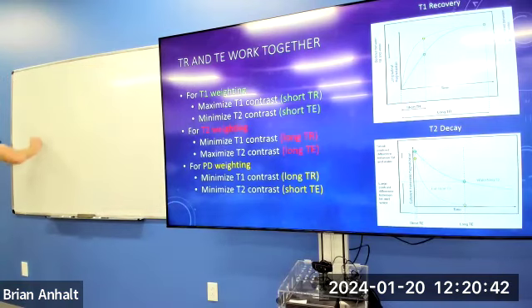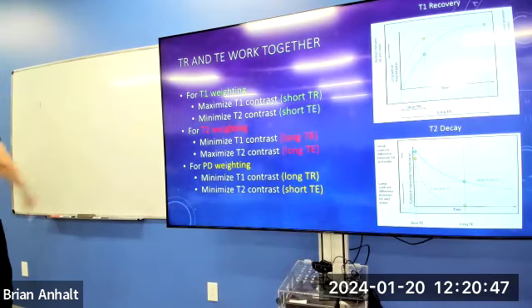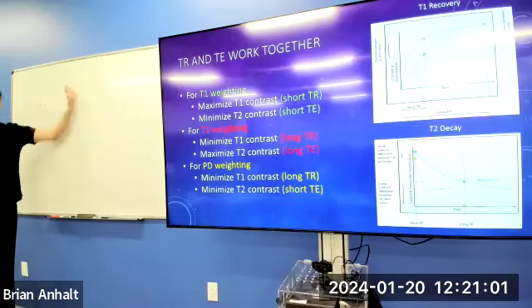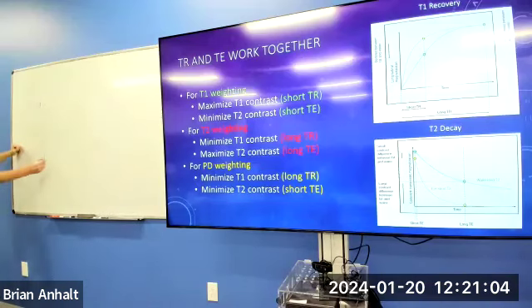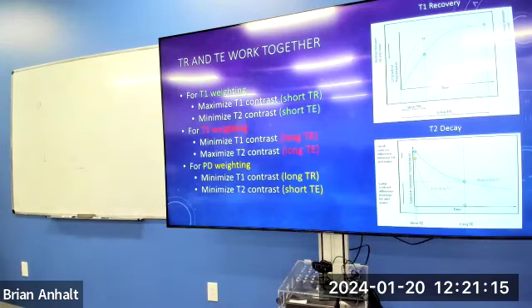So now it's just going to be the NMV at equilibrium that's going to tell the difference, right? Because look, this is our NMV of fat, and this is our NMV of water at equilibrium. Remember, fat is the highest proton density, right? There's a difference, right? So we want to wait for full longitudinal recovery, which we do have at equilibrium. We can wait for that again with a long TR, right? And then when we flip, we want to listen back right away before any T2 decays happen, right? The long TR to allow for full recovery, and then short TE to listen back right away.